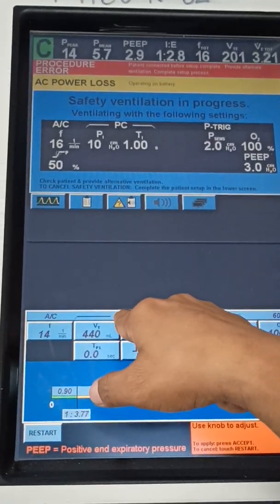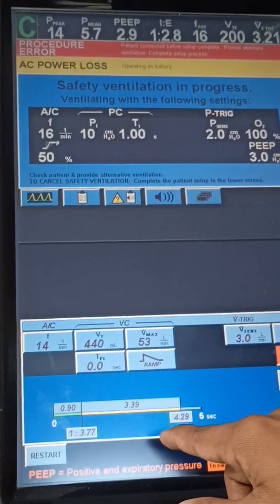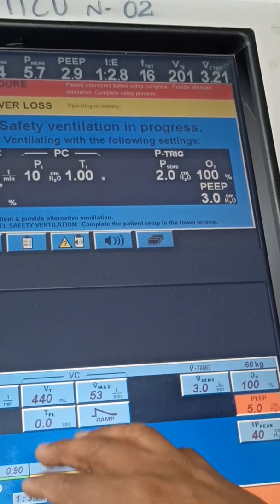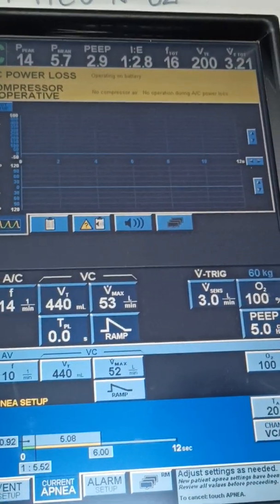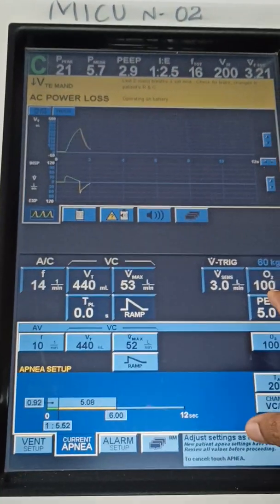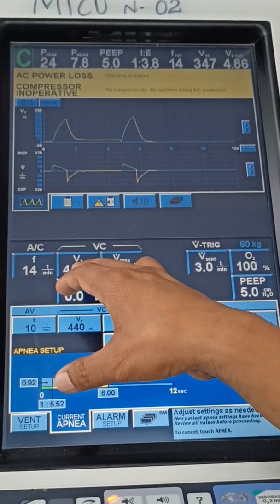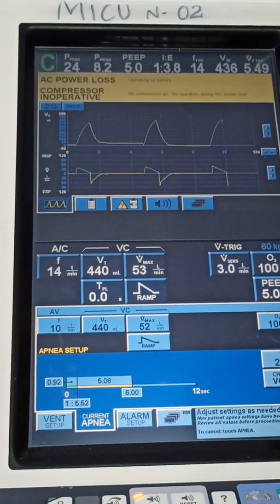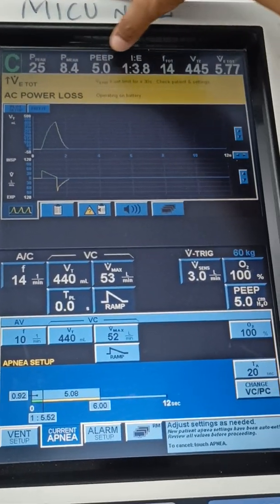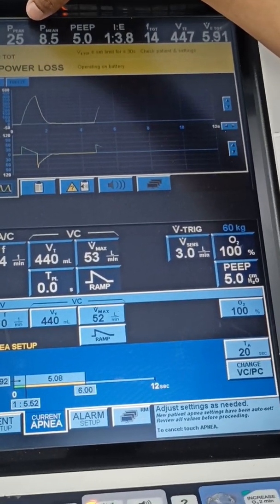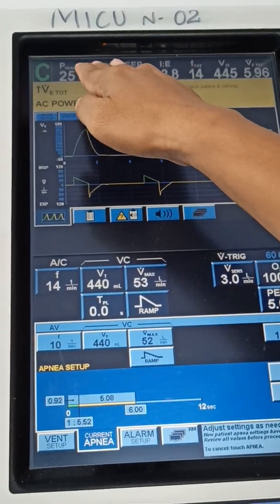In pressure mode, if you select PC-AC, then there will be pressure type of ventilation settings. These are the ventilator setup values I have given. You need to press the accept button — I accepted it. So these are all the ventilator values: rate 14, tidal volume 440, Vmax 53, FiO2 100, PEEP 5.